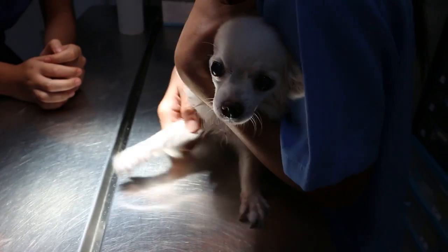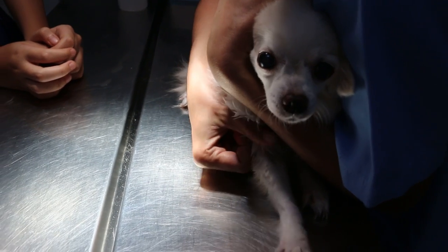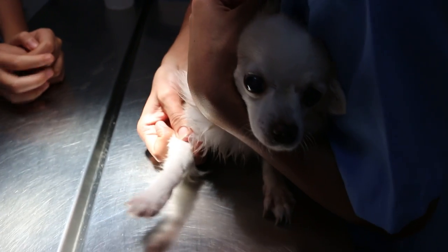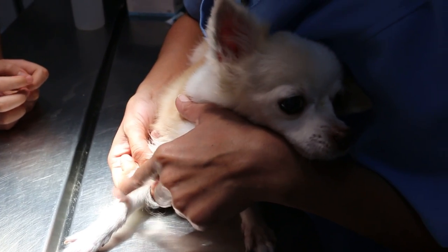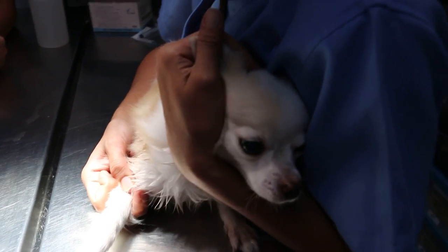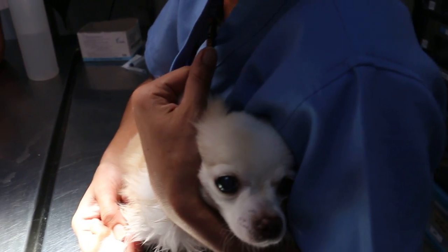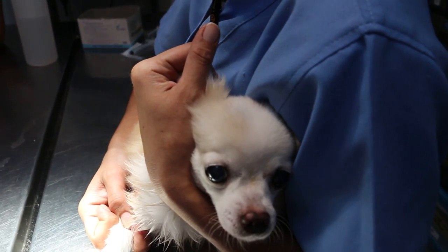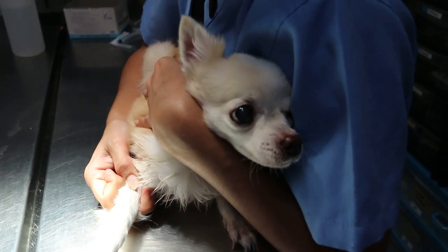So you need to press, you need to pull forward, then press, then turn. So this Chihuahua is moving with vomiting and diarrhea. So that I can feel the vein here. You're still holding up. If she moves, don't let go. Hold close to your body. Especially when I'm already in. You need to restrain her near to the body, otherwise the dog feels it and she won't move.